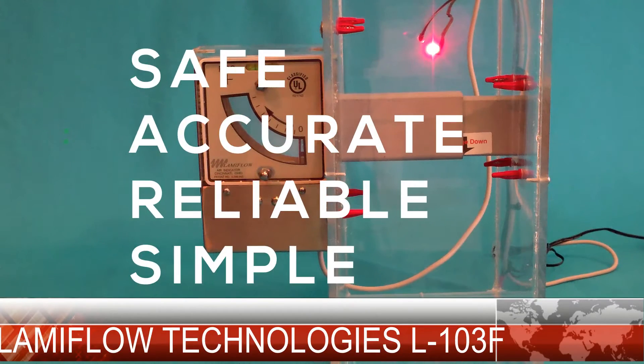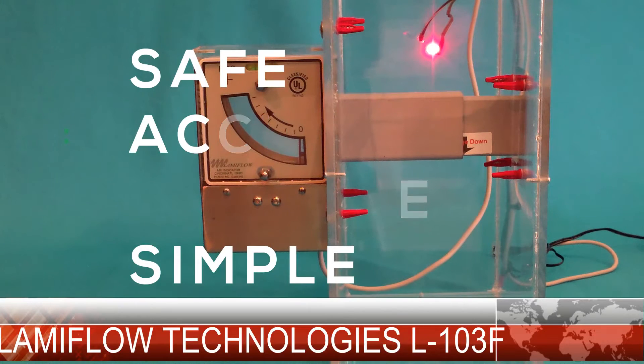The Lamiflo 103 series electronic airflow indicators provide a safe, accurate, reliable, and simple way to constantly monitor airflow for isolation rooms, operating rooms, decontamination, and sterilization rooms, just to name a few.